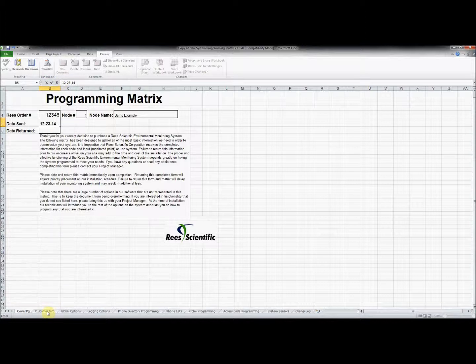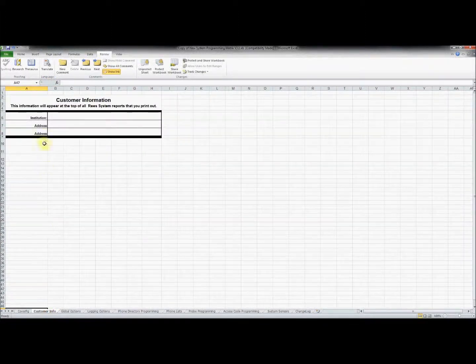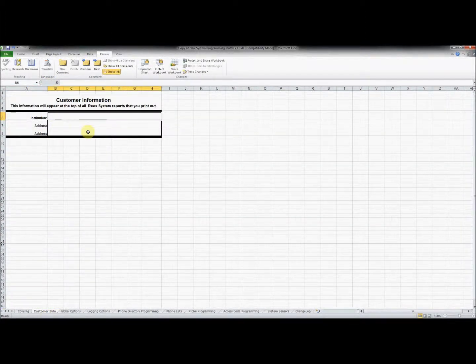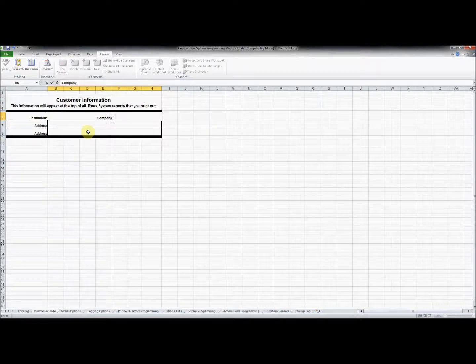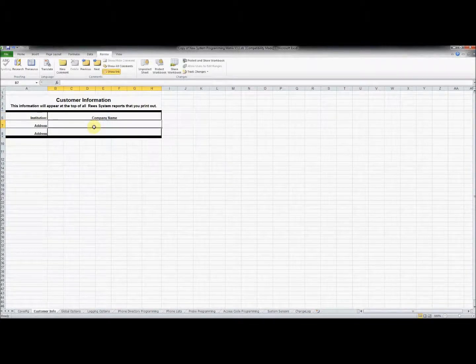Now we can move on to the next tab, Customer Info. Type in your institution name and address here. This information will appear at the top of all system reports.